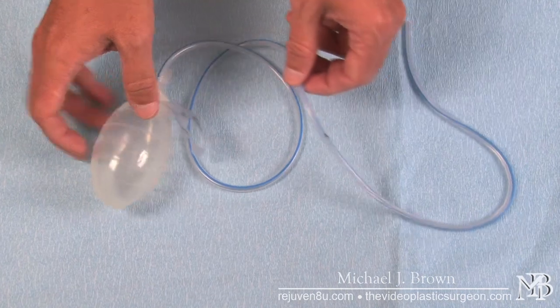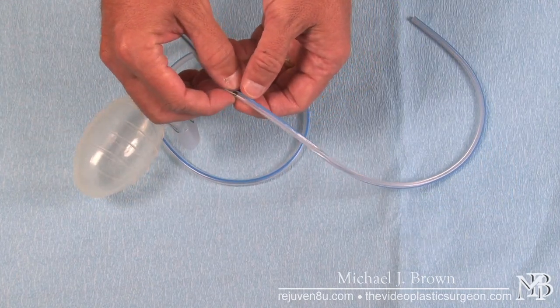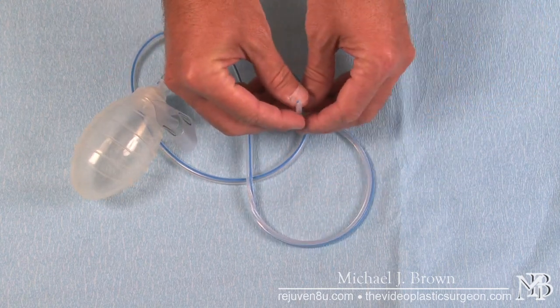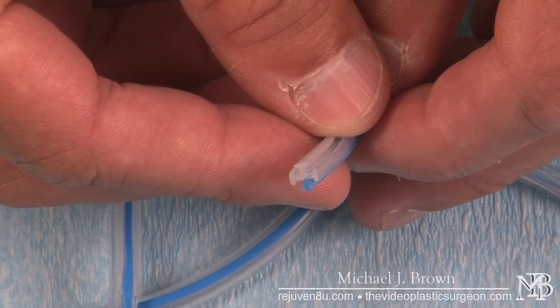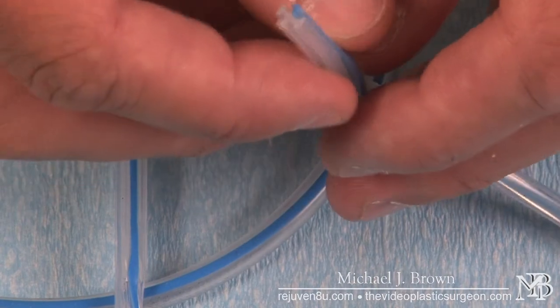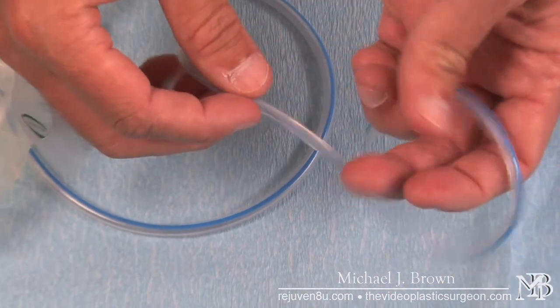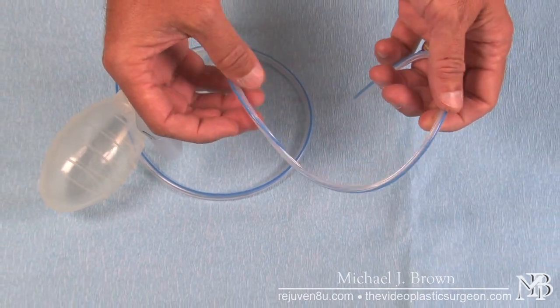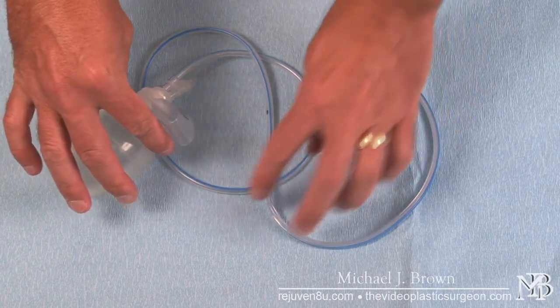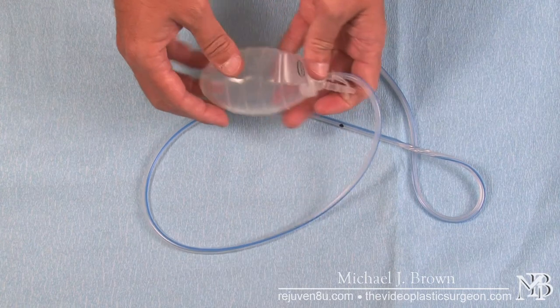This black dot is a reference point we use to show how deep the drain is actually in the patient. This is the end of the drain that goes into the patient, and you can see it's actually fluted. The fluted drain is the part that goes inside the patient, and we can trim this length depending on the size of the wound. This is the part that sucks fluid into the drain tube, which then collects in the reservoir.